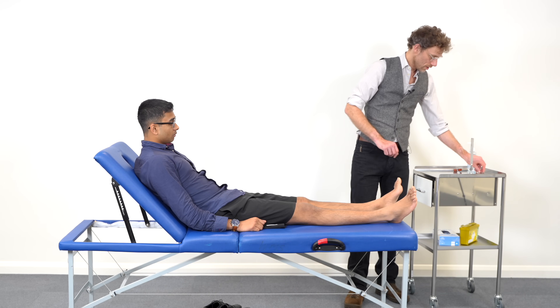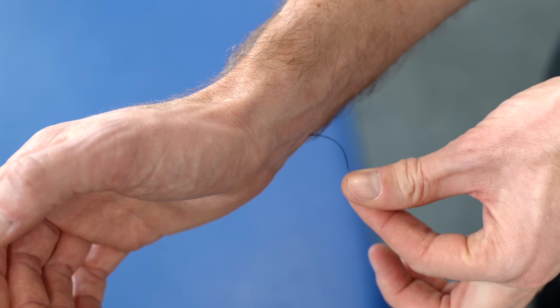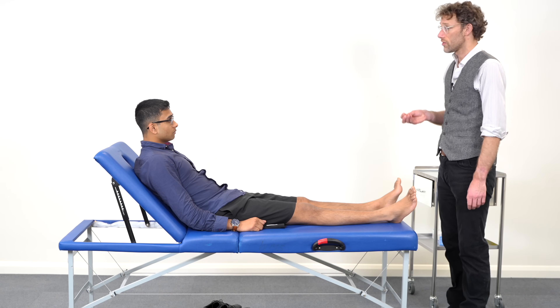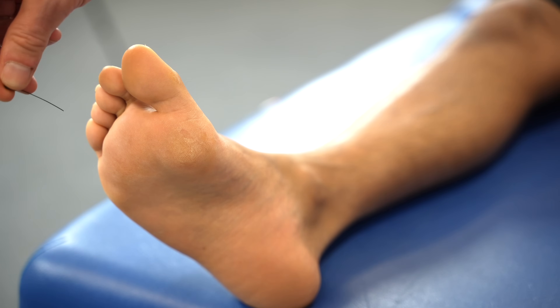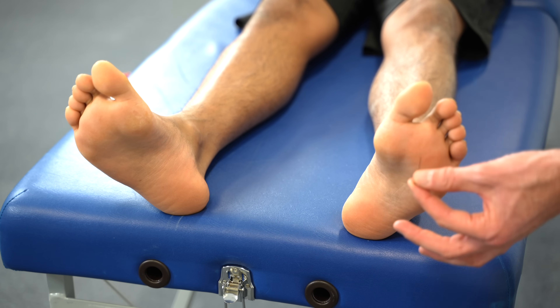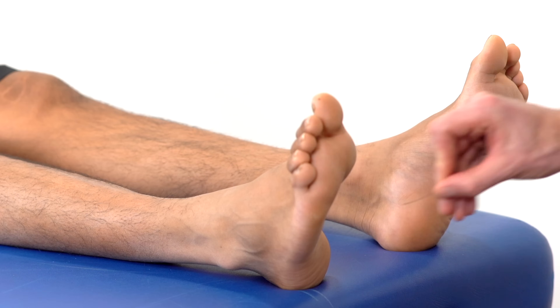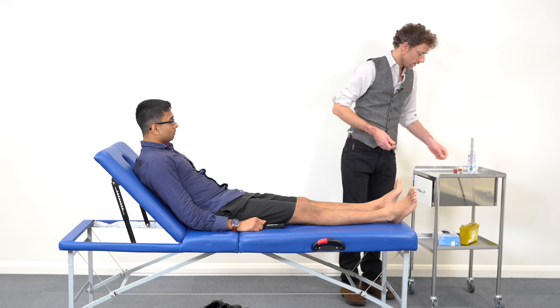Let's have a look and see how you are with sensation. This is a monofilament — a little piece of plastic that bends when we put force through it, so it's not going to do any harm. I'm just going to touch your chest first so you can feel me touching you there. I'm going to do the same on your feet. I need you to keep your eyes closed and say yes when you feel me touch you. So close your eyes please. [Patient responds yes to multiple touches across both feet.] There are no problems with the sensation there.